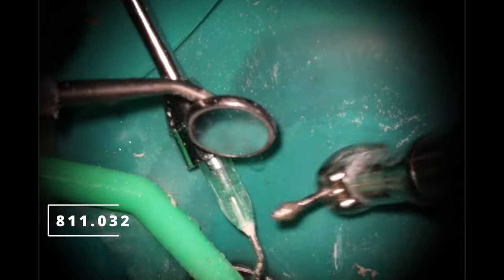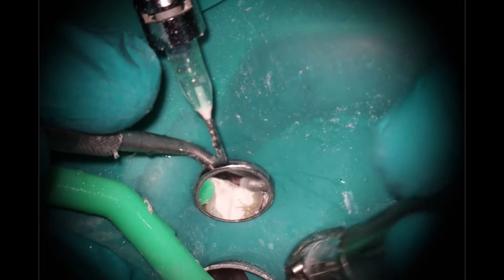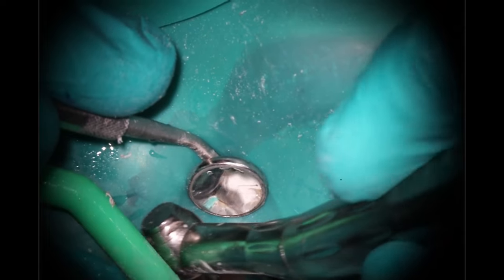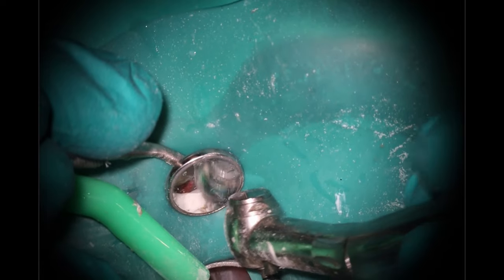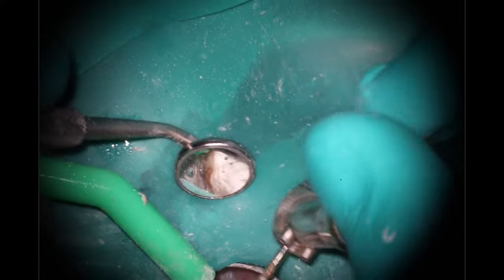What else can you say as far as the efficiency with this aspect? I think the idea here is: always be cleaning up. One of the key components we do is making sure that one of us is always doing something. That means sometimes the doctor holds the curing light while the assistant cleans up, or vice versa — I'll hand it to her and I can switch out the burrs. Look for those small little moments; it seems silly but it really does add up over time. The time in this video — it took about eight minutes from start to finish, from the final check film to taking off the rubber dam.